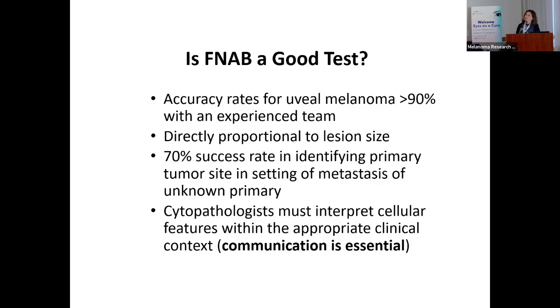Cytopathologists must always interpret the features that they're seeing on the slide in the context of what's going on with the patient. So we have to know what's happening. We have to communicate with our clinical colleagues.